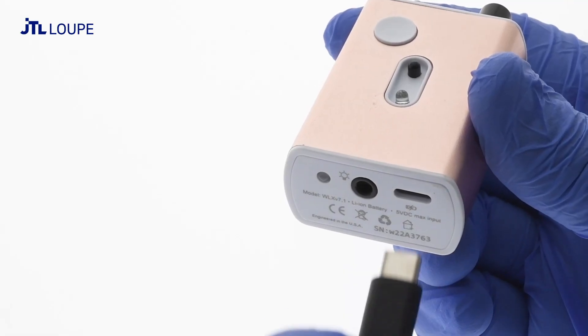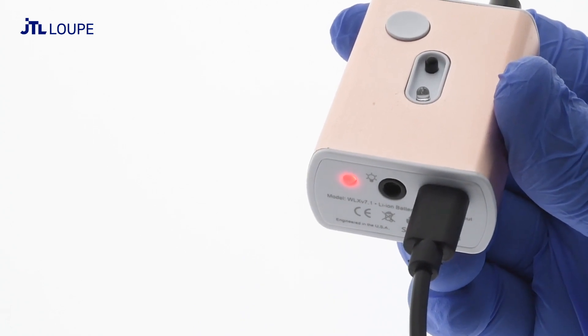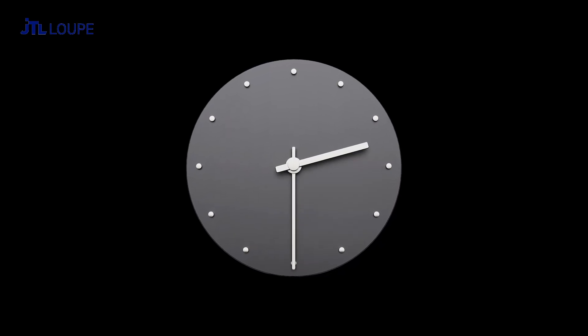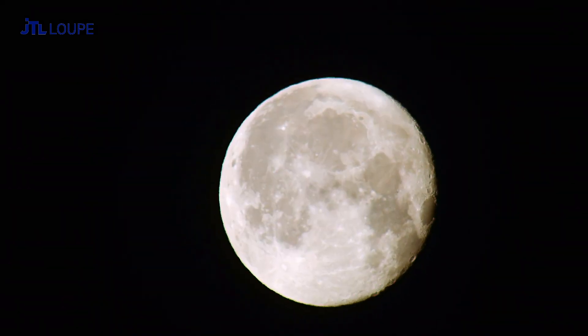Use the included USB-C charging cable to charge the battery. The battery features a charger indicator light — red is charging and green is charged. Do not leave it plugged in for more than two and a half hours or when it is fully charged. Do not charge overnight.